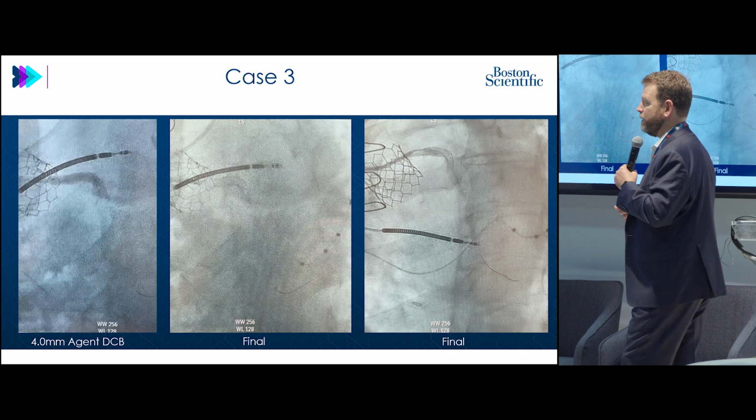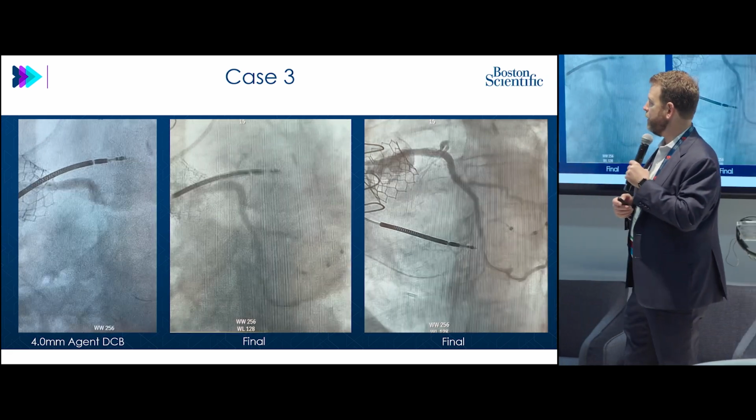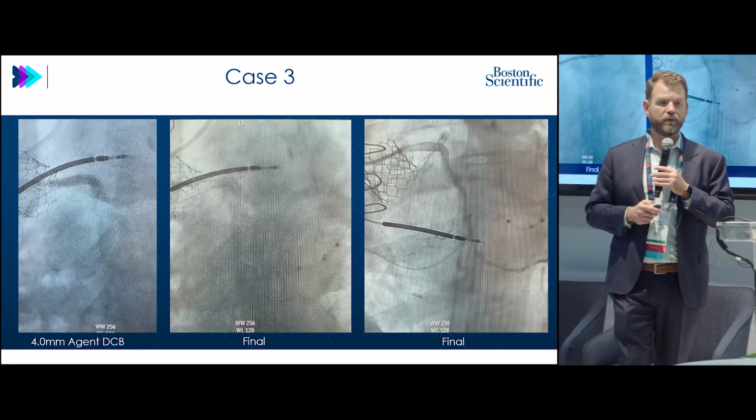Now it's time for agent. We've got our 4.0 agent there. We leave it up for 120 seconds, and we have an excellent angiographic result. In this case, it probably took roughly 20, 25 minutes.